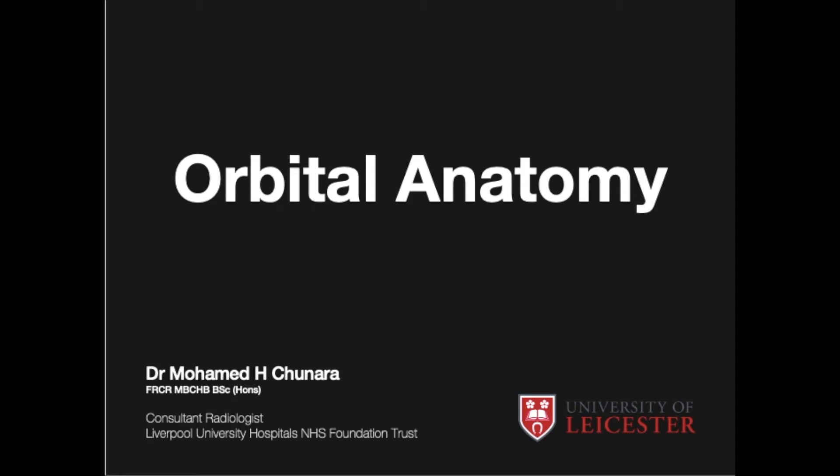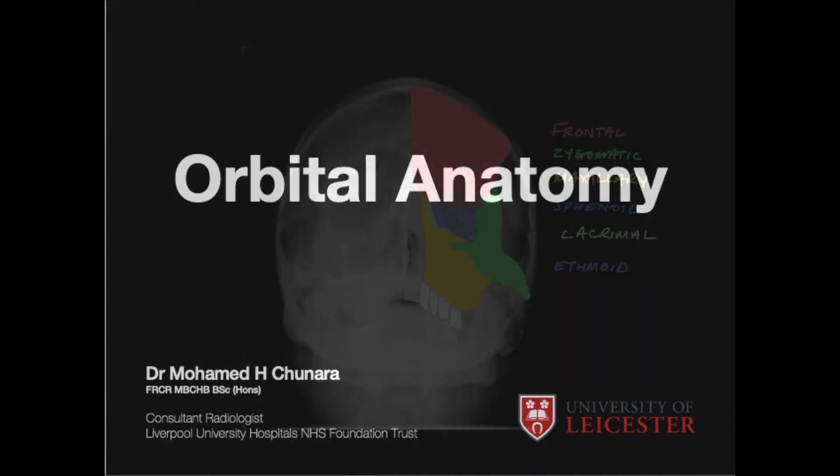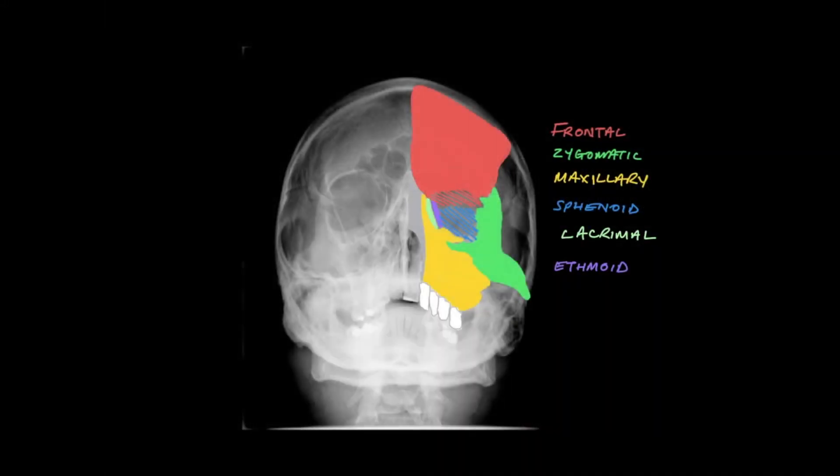Hello, I'm Mohamed Tunara. In today's video we will be reviewing pertinent radiological anatomy relating to the orbits. This is a frontal orbital radiograph. I've overlapped and annotated the left side of this image to help give you an idea of the bones that contribute towards the bony orbit.